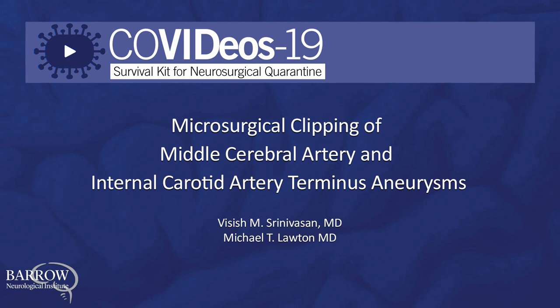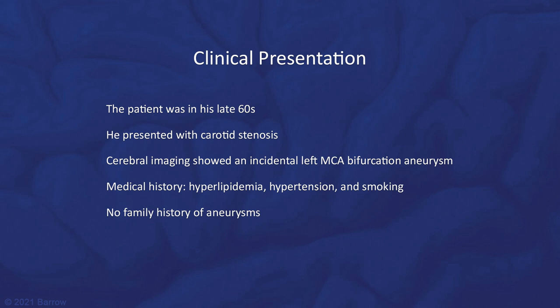This video will demonstrate microsurgical clipping of middle cerebral artery and internal carotid artery terminus aneurysms. The patient was in his late 60s. He presented with asymptomatic carotid stenosis and cerebral imaging that showed this incidental left middle cerebral artery bifurcation aneurysm. His past medical history was notable for hyperlipidemia, hypertension, and smoking. He had no positive family history of aneurysms.